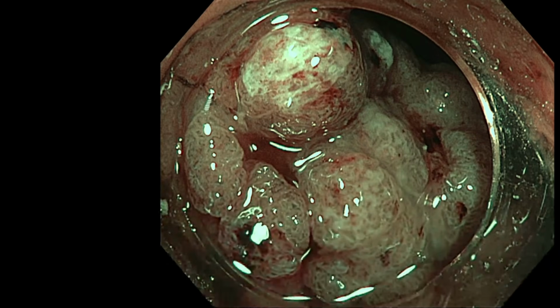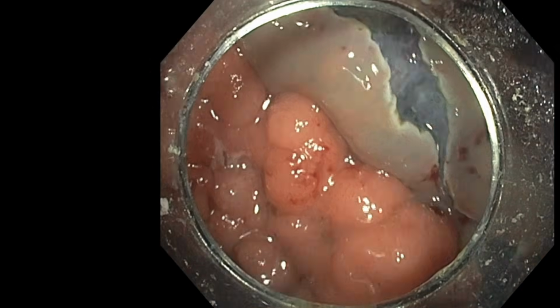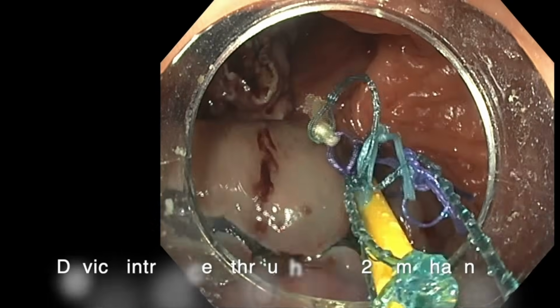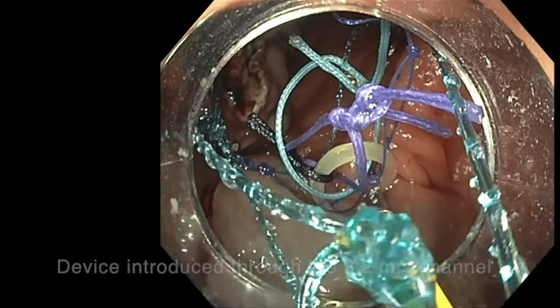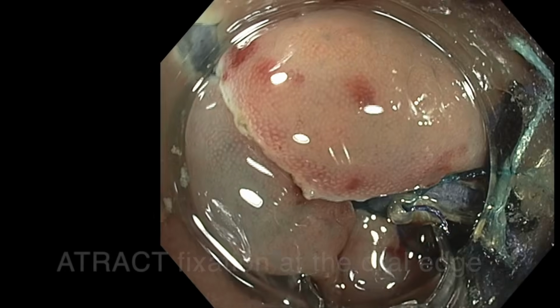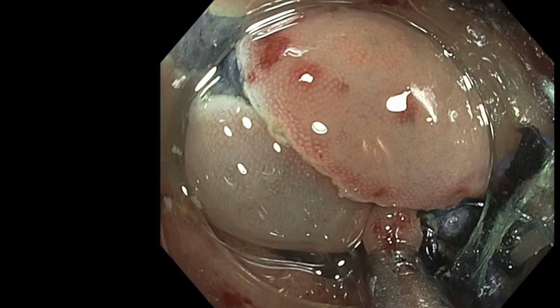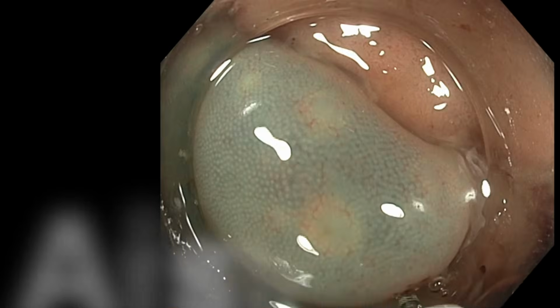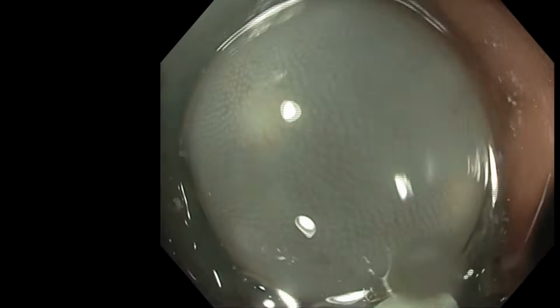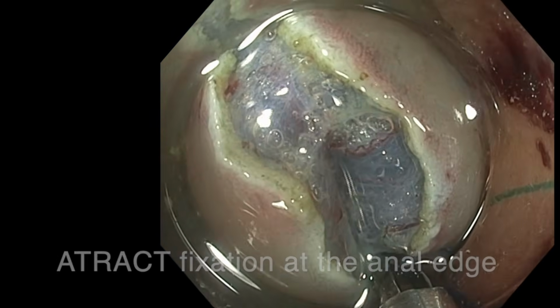It's not the same lesion, but it was a similar lesion with an area of pattern which was quite difficult. I did first the oral incision, introduced the device of traction, and fixed the first point on the oral edge where the incision was completely done with trimming. Therefore, I did my anal incision with a relatively deep incision from the beginning.